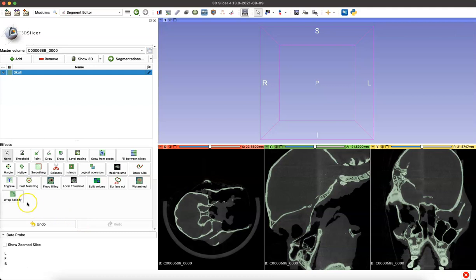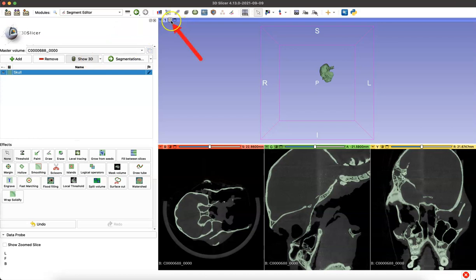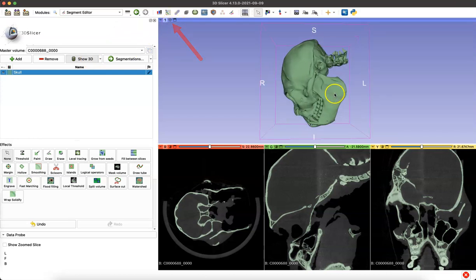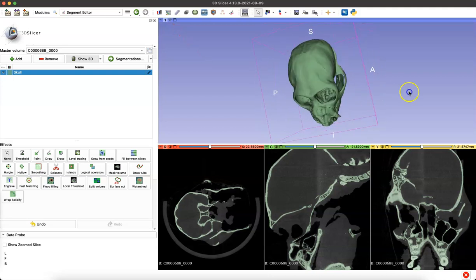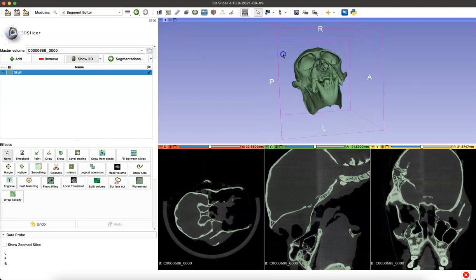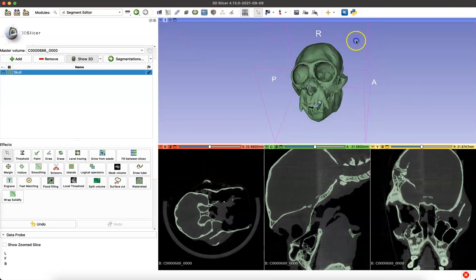We can visualize what we just created by going to the Show 3D button, which will bring it into the 3D space. And if we click that target symbol, it will center our module in 3D space, and we can just zoom up.